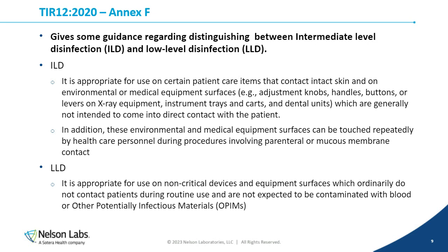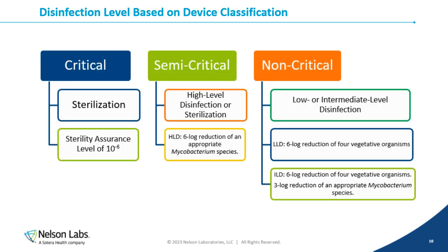And it's important to choose the right level, because that'll affect how the validations are performed. It'll affect how stringent the requirements are for your device. So you want to make sure you choose the right disinfection level for your particular device.